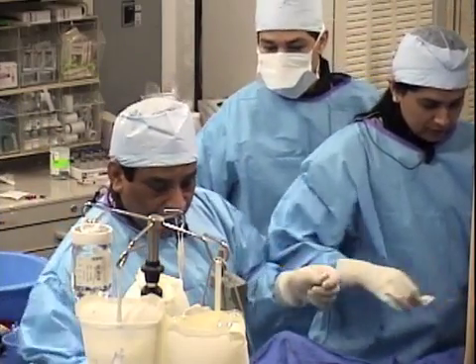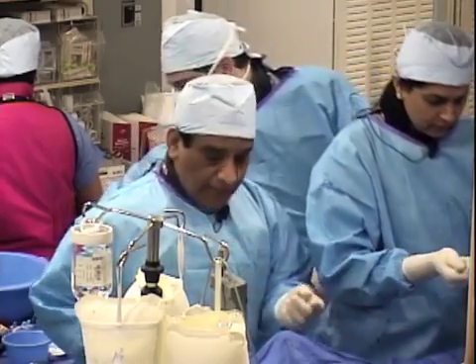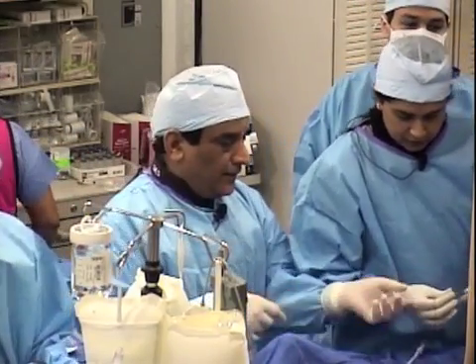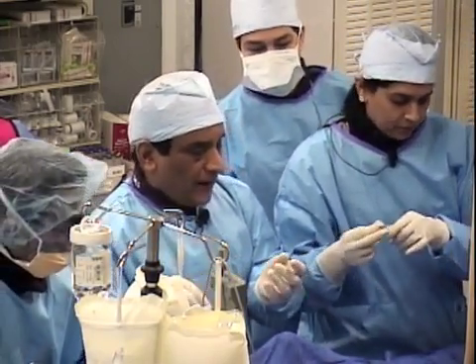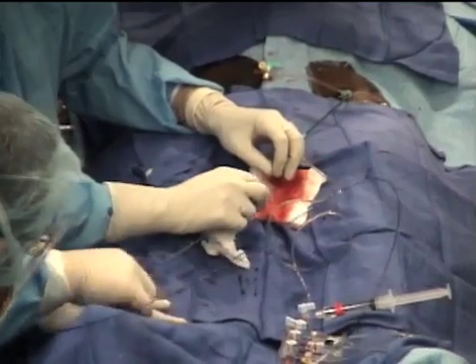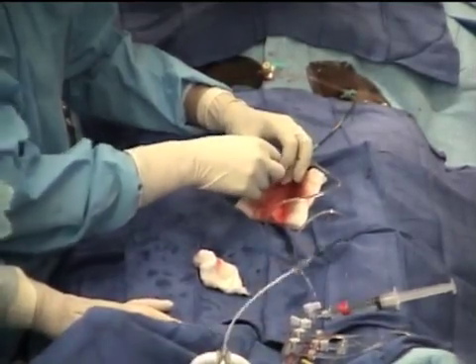Other point, we have actually seen that once you make it a monorail, the ease of device use clearly improves. So now we have done it, the Rotawire has been advanced, and now we'll do an IVUS on the Rotawire. Now many people actually do the stent on the Rotawire, but we don't do the stent on the Rotawire, because after the Rota we put a regular wire. But in this particular case, we already have the Rota easy. Now in a difficult case, don't use the Rotawire directly. You need to go through your regular workhorse wire, and then exchange. But in this case, we are ready for the IVUS.